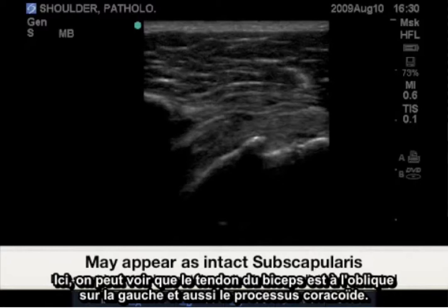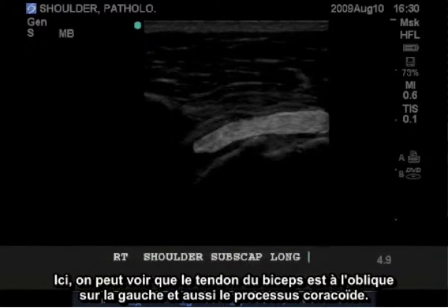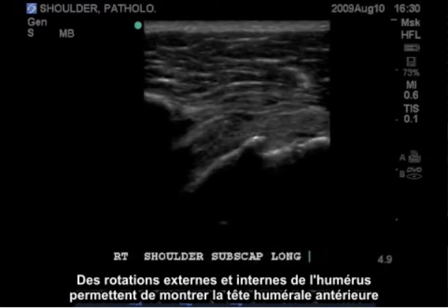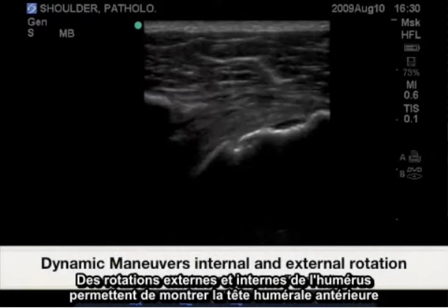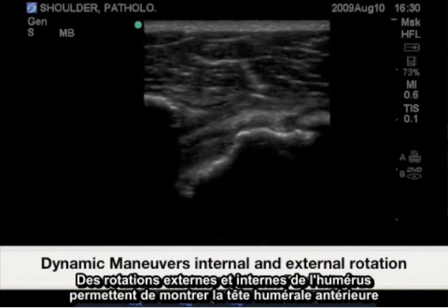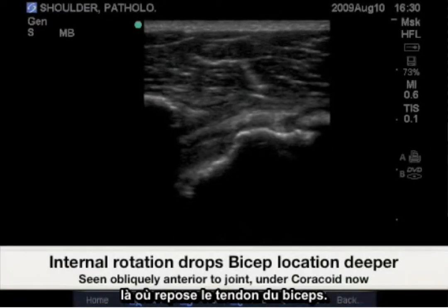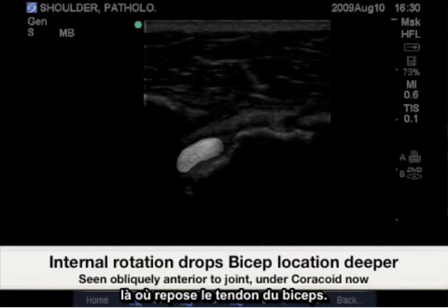Here we have an oblique bicep tendon on the left, also the coracoid process. Internal and external rotation of the humerus will show the anterior humeral head where we have our bicep tendon resting.